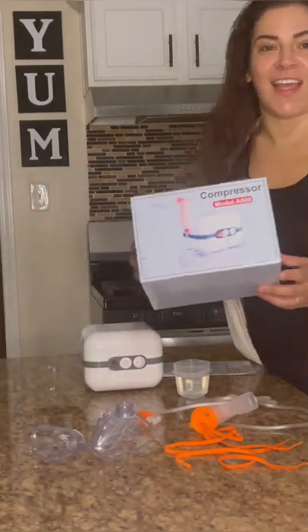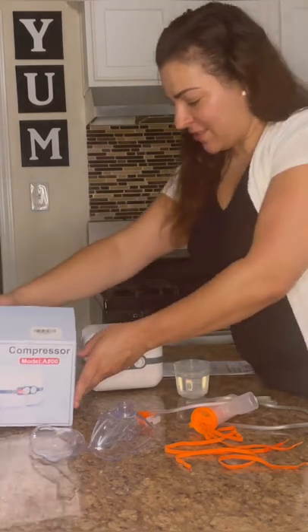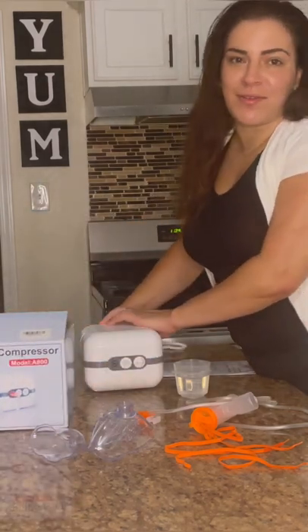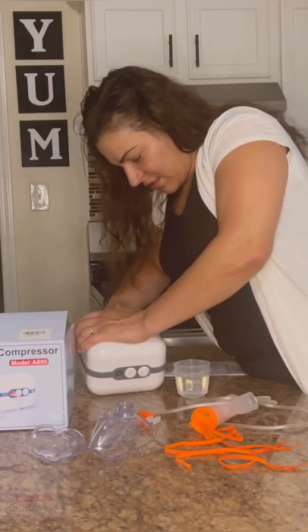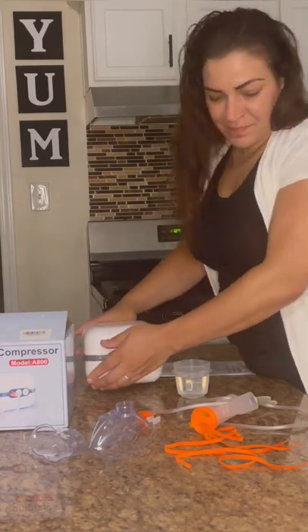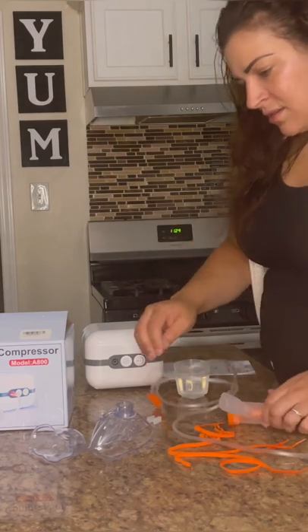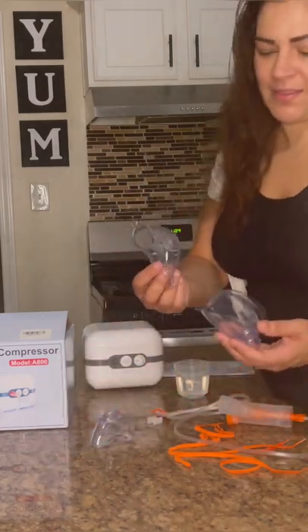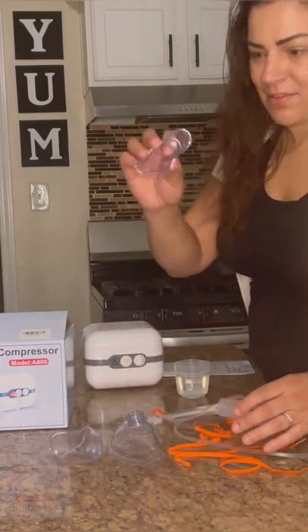Hi guys, so today on Run Run Deals, I have this Compressor Nebulizer Model 8800. It comes with this power cord — it's 40 watts, 120 volts. It comes with this hosing and three different size face masks: adult, child, and looks like infant.